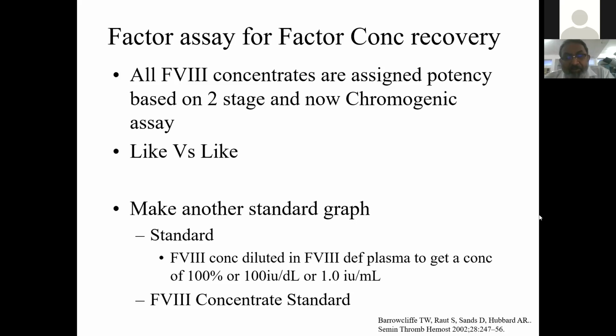I realized over a period of time, this article was published. He has written a few articles based on that. We adapted this method, and we found this method absolutely useful. We were doing chromogenic assay, but chromogenic assay in our country is far more expensive than a one-stage assay. In Europe, I think basically because of pricing, they don't find much difference between the one-stage assay and chromogenic assay. And one-stage assay automation is a little bit more challenging than a chromogenic assay. So therefore, they don't do one-stage assay, and this like versus like principle was never practiced. So nobody has data on the like versus like principle.